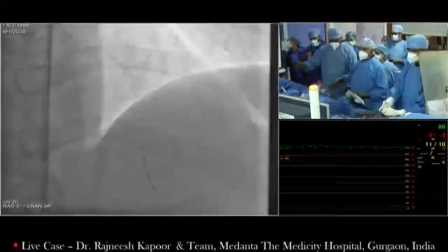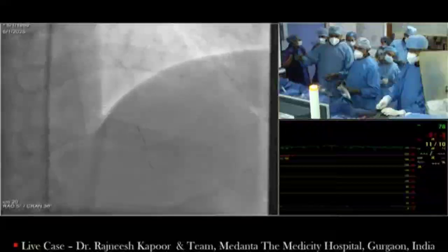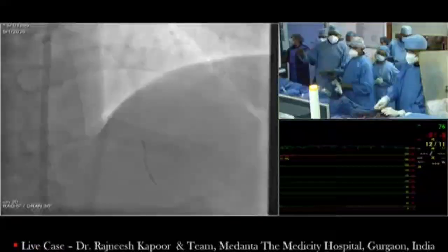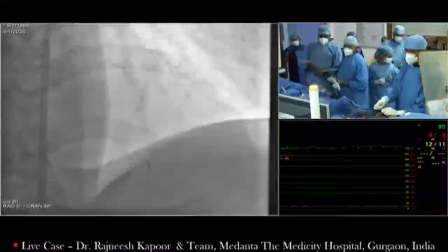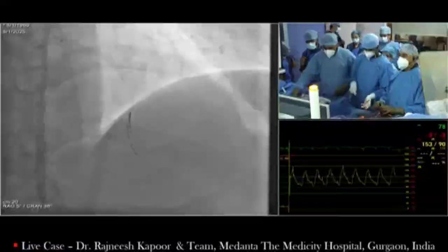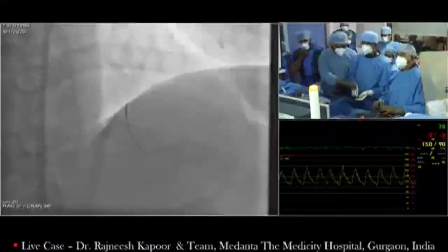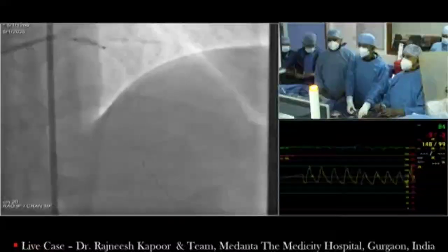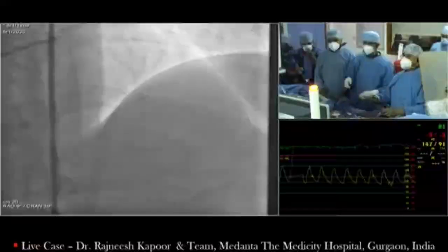Is there any regulation that precludes or does not preclude doing these types of procedures at sites that do not have surgical backup? Our guidelines say we shouldn't be doing rotational atherectomy without on-site surgery. We should have a balloon movement much smoother, and that's what we are expecting. Can you tell us a little bit what you are doing and what your plans are now?